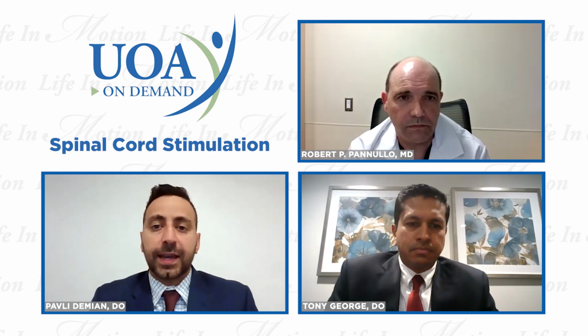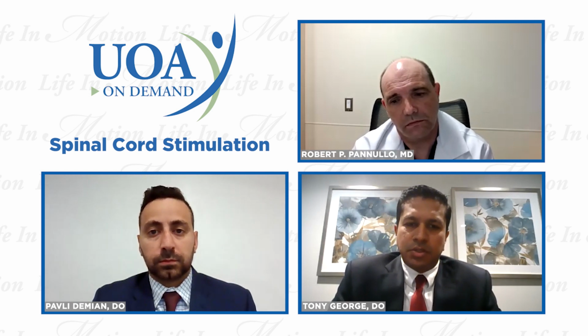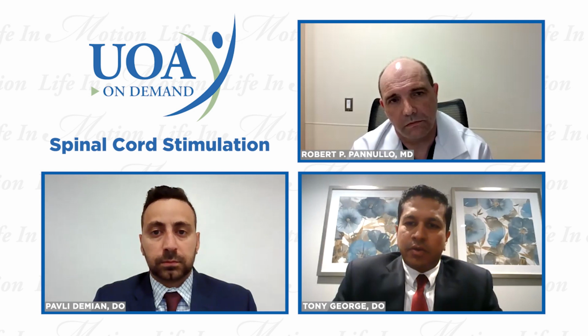And Dr. George, can you let us know, if a patient was a candidate for this, what's the process that the patients would go through? So typically patients come in with back pain. They've either tried injections, epidural injections, nerve blocks, ablations, and have even gone to the extent of having spine surgery to address their issue. And if they don't get relief and they still have this persisting nerve pain, then I typically see if I can still challenge my patient and say, can I give you some relief?